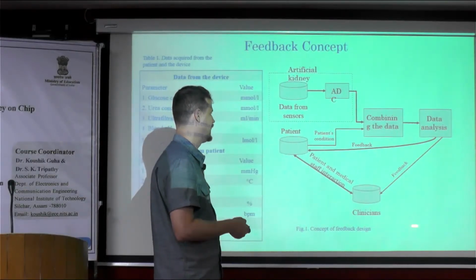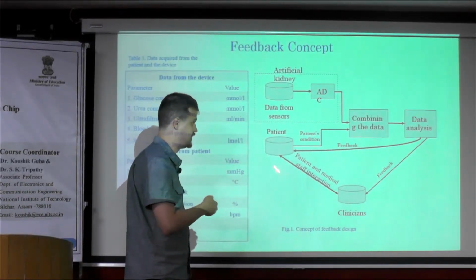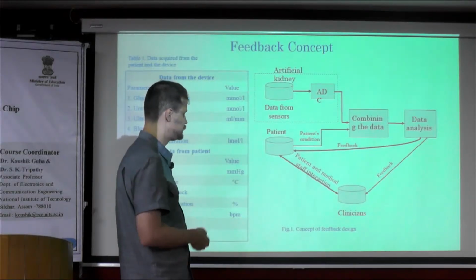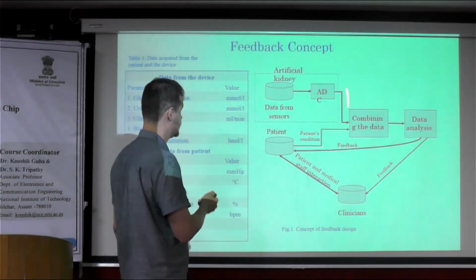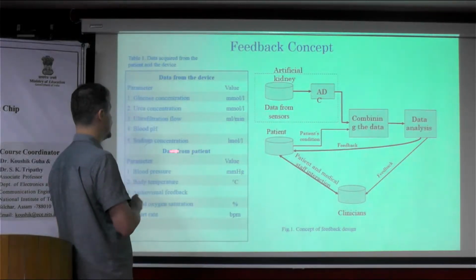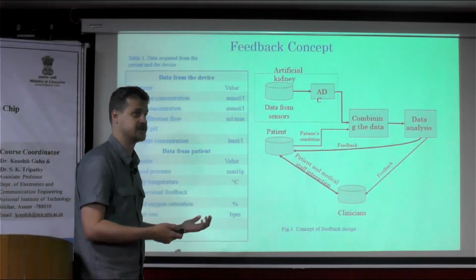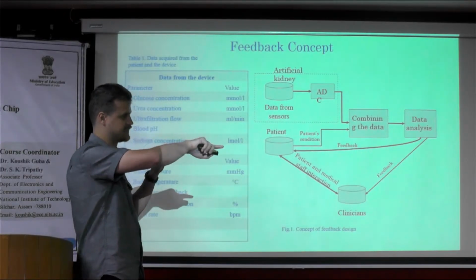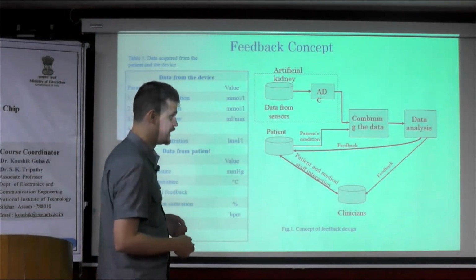We also have to organize the feedback between the clinician and the patient, because the patient is the biological system that directly interacts with the artificial kidney. It's not just that we acquire data from the device and look at how the urea concentration changes at the entrance of the microfluidic system and at the outlet of the microfluidic sensor.